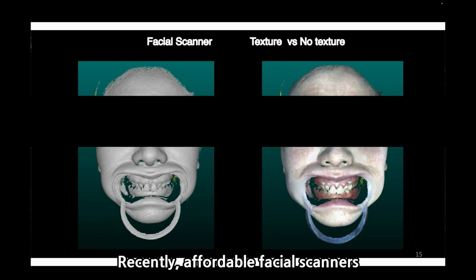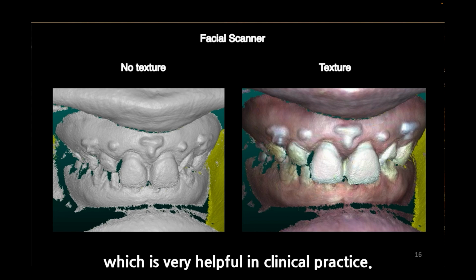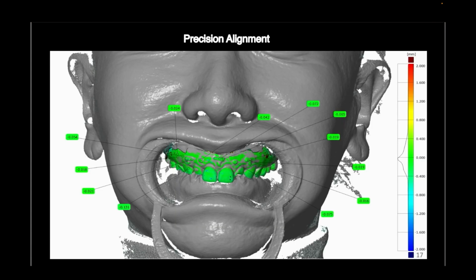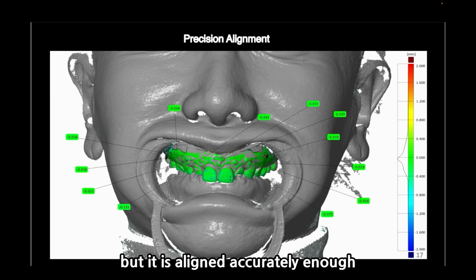Recently, affordable facial scanners have become available, which is very helpful in clinical practice. Please keep in mind that the texture can make the scan file appear better than the actual property. In this case, the required accuracy for alignment is slightly lower, but it is aligned accurately enough with the oral scan.